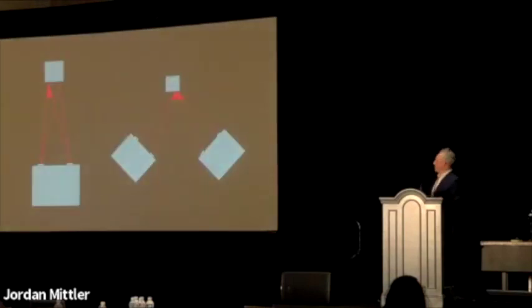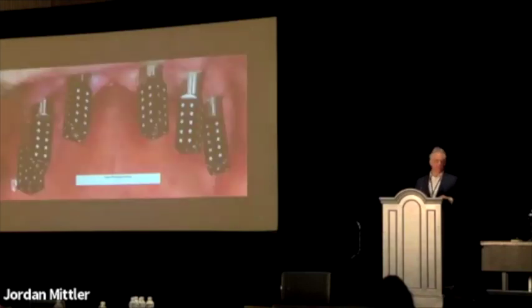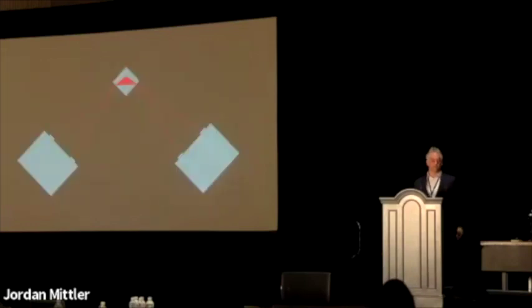If you look here at the slide, you've got 2 cameras, and it's just recording the relationship of one surface with another. I think where iMetric is helpful is that you have 3 surfaces. If you look here on the screen at these scan markers, you have 2 side surfaces plus the top surface, and the cameras are reading them. So you have 4 cameras taking pictures of 3 surfaces, and that relates to a lot more data we're acquiring with the same amount of photos. Okay.